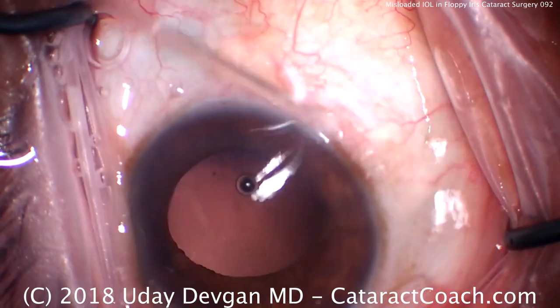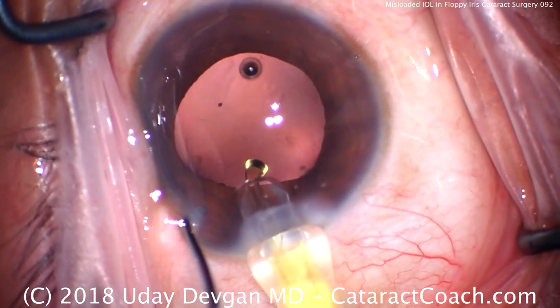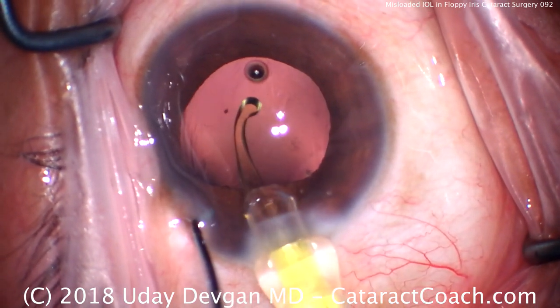The technician hands me the lens and we start to inject the lens and we notice — wait a minute — that's just a single haptic. What should we do?